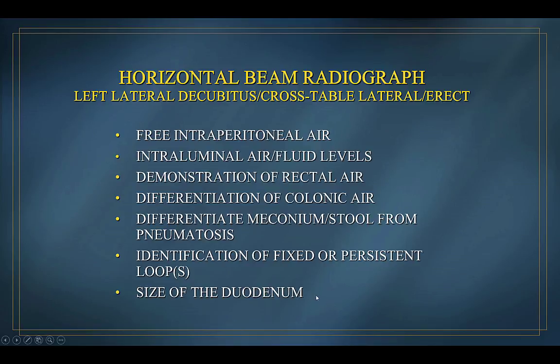And this last reason is more important for babies that have congenital upper intestinal obstruction, because you always need to know the size of the duodenum. And I will briefly discuss upper GI obstructions in the third part of this series.